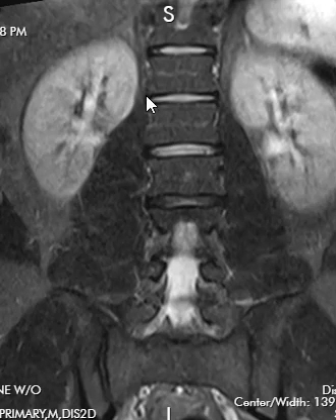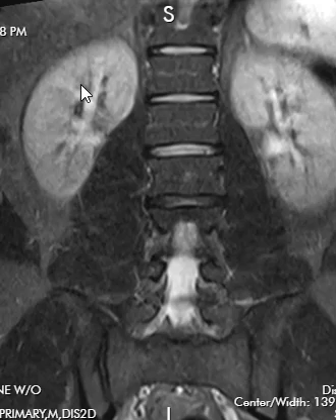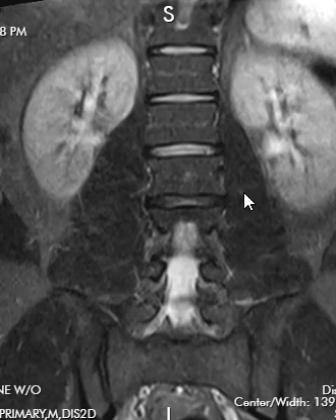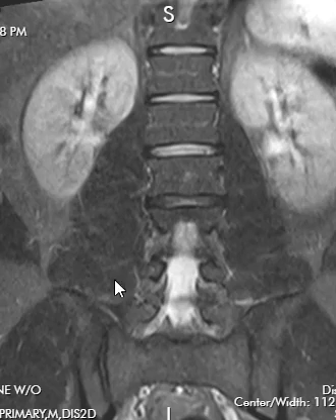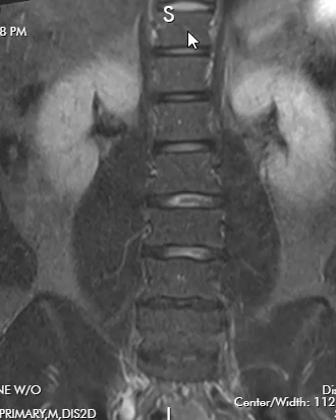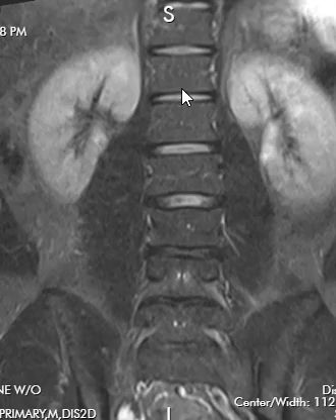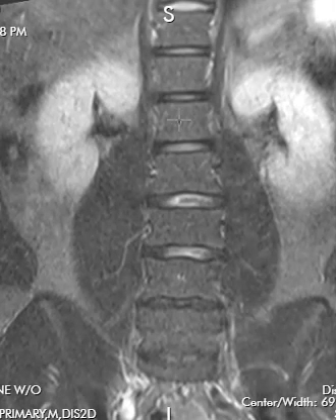Here's the right kidney — see if that's normal in size, equal in size to the left kidney. It looks like a bean here. Make sure there's no renal tumor, no cyst, no obstruction — so these kidneys look normal. These are called the psoas muscles, these dark areas coming off the spine, here's the right side and left side. You can see the vertebral bodies here and make sure there's no abnormality within them.